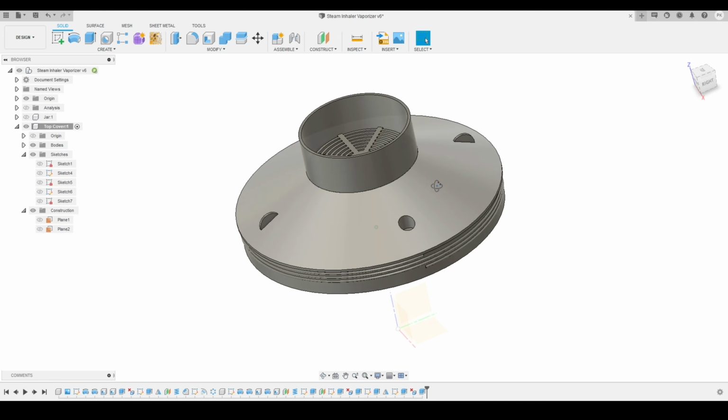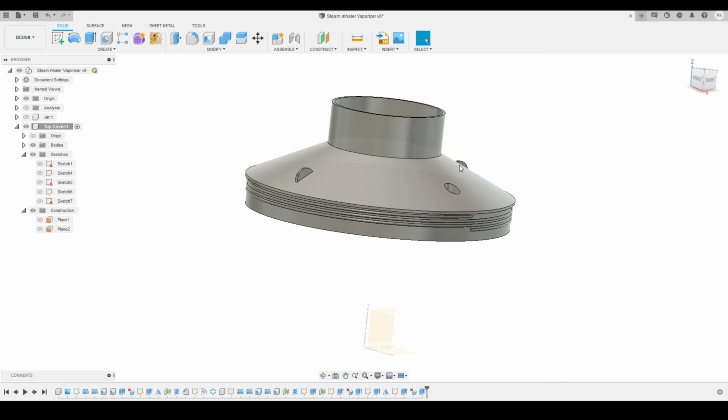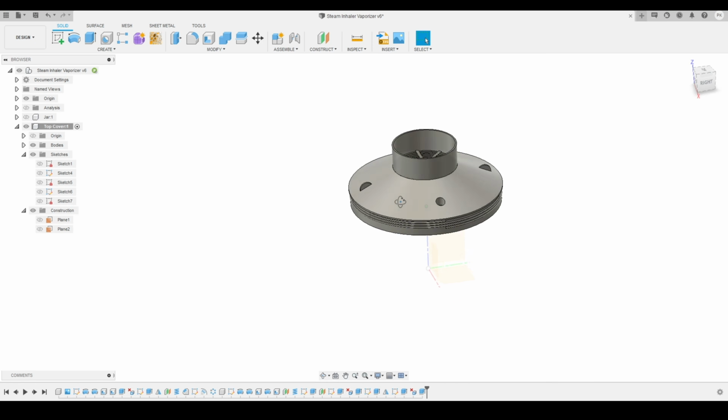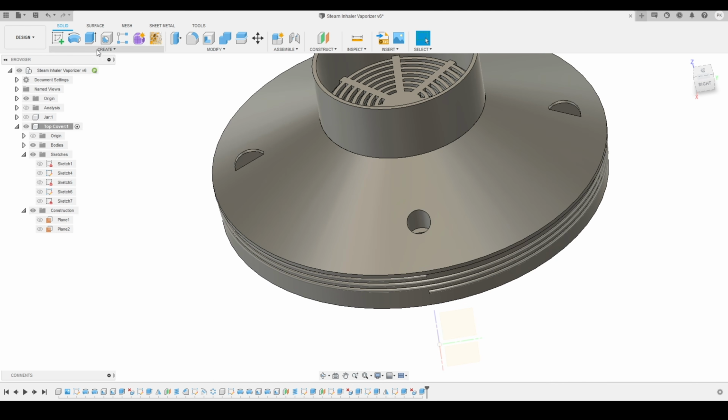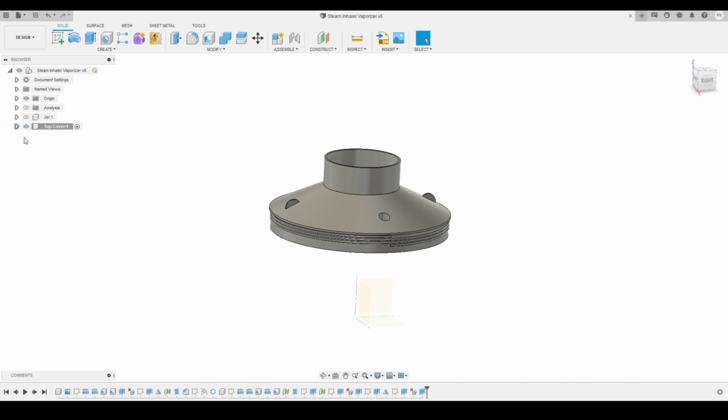So this is especially for the wires. The wires are going to enter from this particular hole, and I had created something like this. So this hole will be for the heater that we are going to attach inside the vaporizer. Now I will click on save, and here you can see this is the result we had created so far. So I think we are pretty happy with the results.